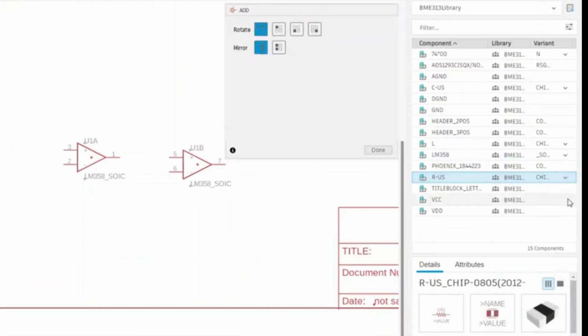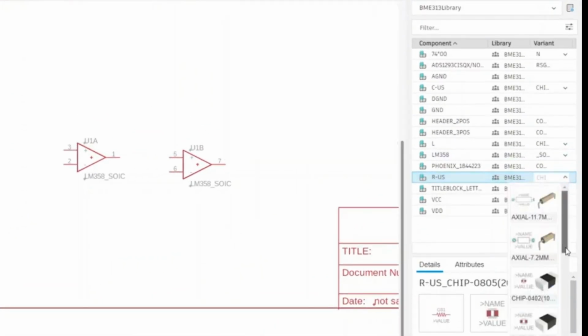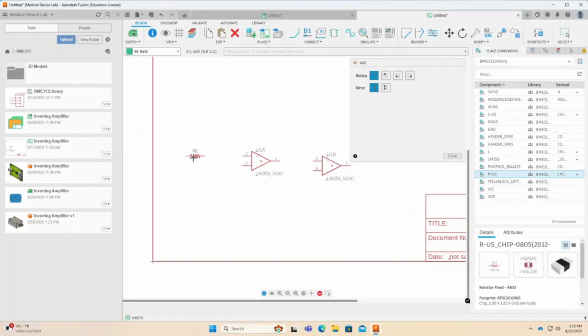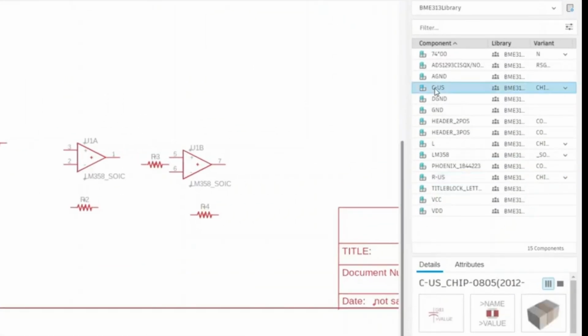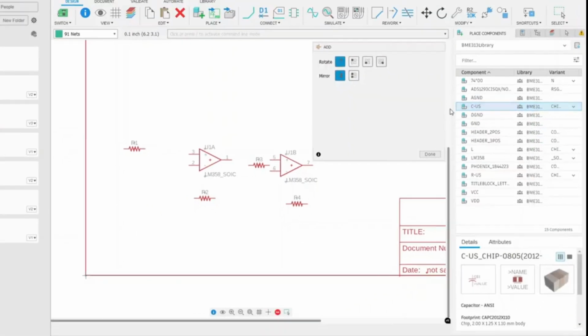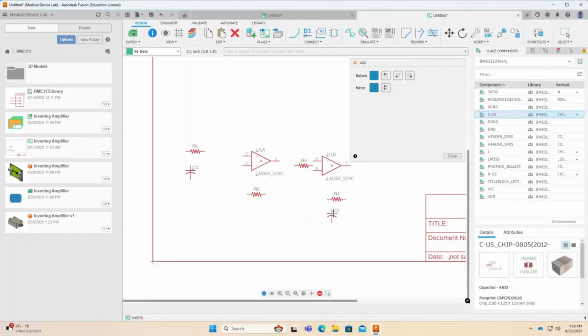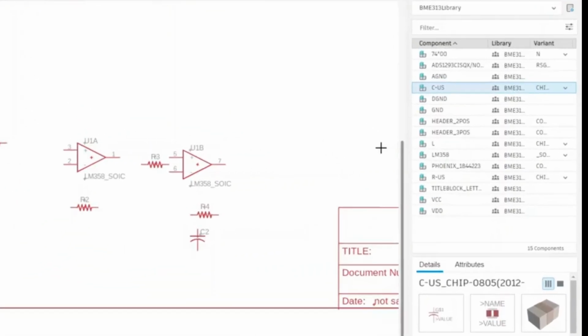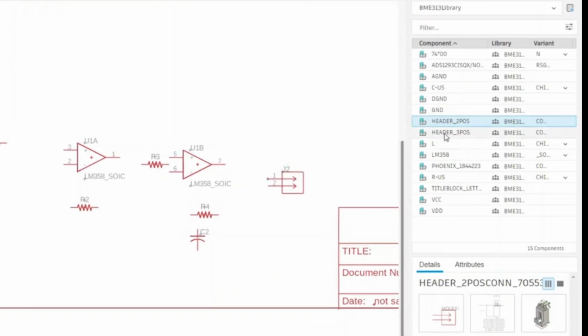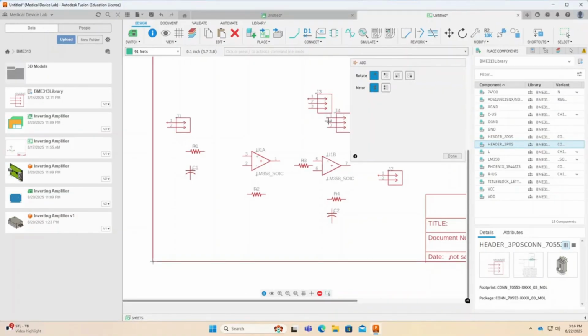Next, add 4 resistors, making sure the package is 0805. Place R1 through R4. Then add 2 capacitors, C1 and C2, also using the 0805 package. After that, insert the connectors. 2 2-pin connectors for signal input and output, and 1 3-pin connector for the power supply.